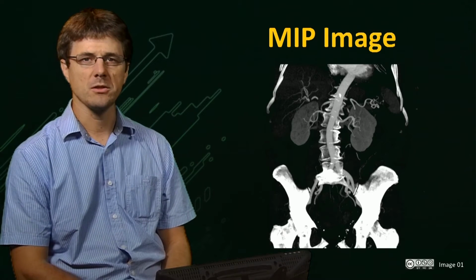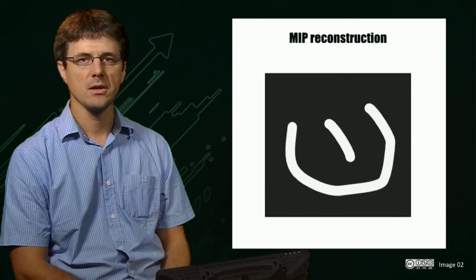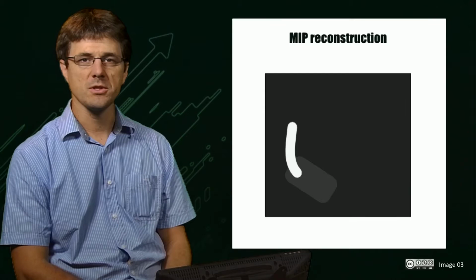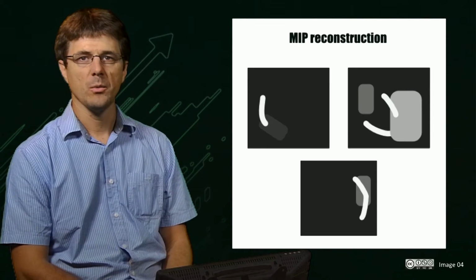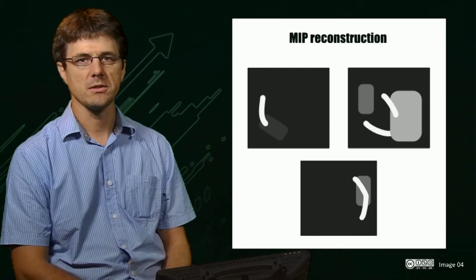We'll use a schematic to understand this process. In this figure, we have some bony structures represented by the white lines. The bones, however, are over multiple slices and have other occluding structures. So the first slice will contain some of the bone and an occluding structure. We can see the bony structure over a total of 3 slices, with other structures occluding various parts.